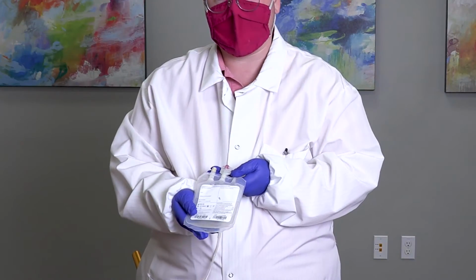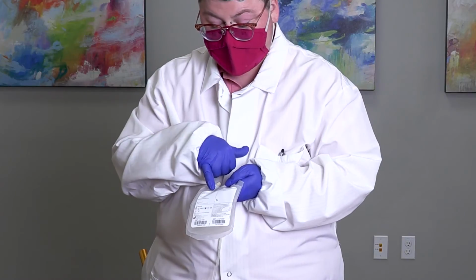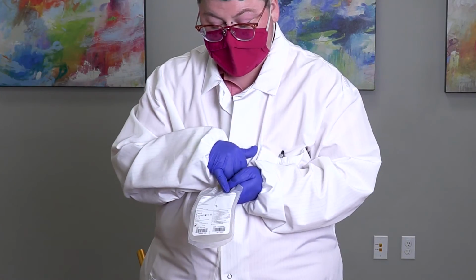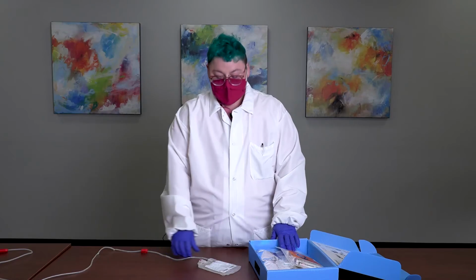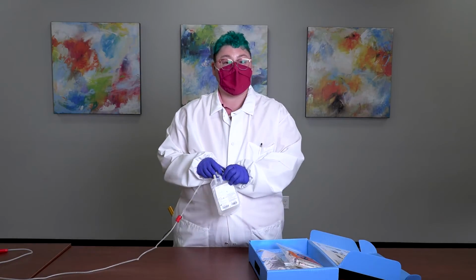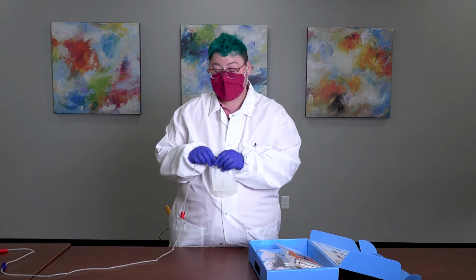This collection bag has been designed specifically for cord blood collections and indicates on the bag, cord blood collection bag. This bag does not require a base label, and your patient label can be applied directly to the collection bag. The C-section collection has been completed, and the bag has been properly labeled. It is now ready for packaging.